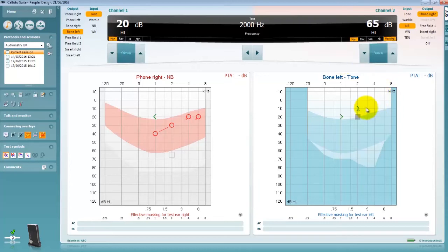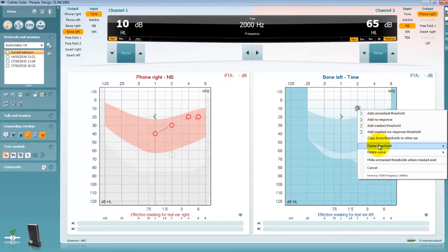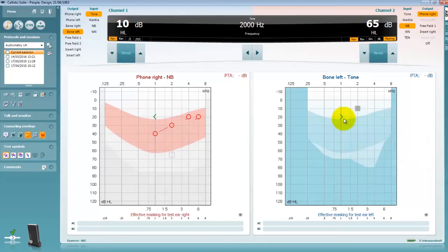To delete a point if it's been added in error you can right click on the point and choose to delete the threshold or you can delete the curve.